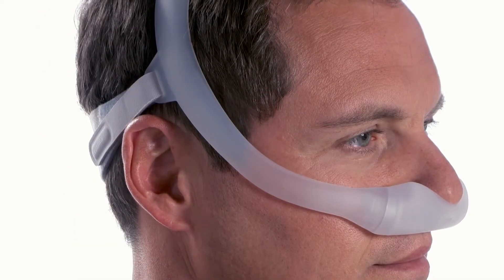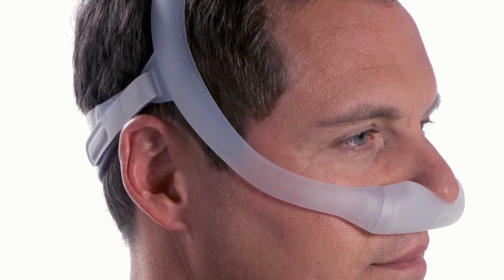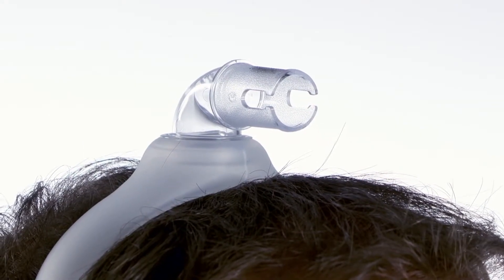When seated correctly, the frame will rest between the eye and the ear. The mask frame should not fall back close to the ears. The elbow will be positioned at the top of the head.